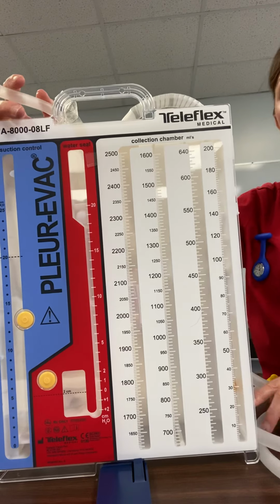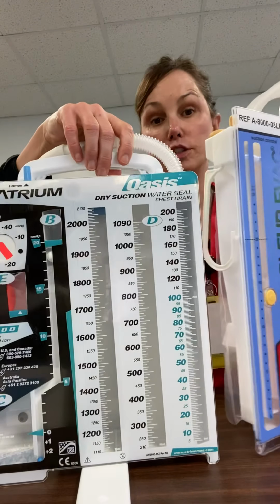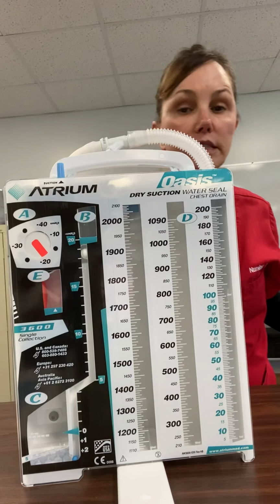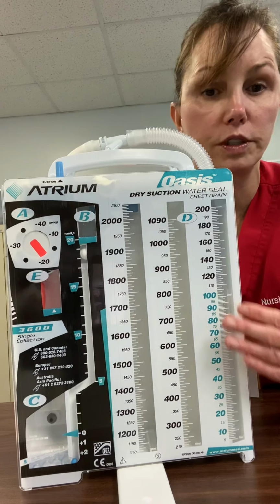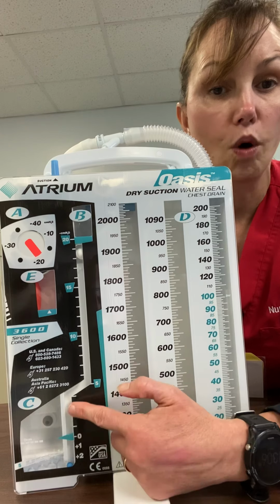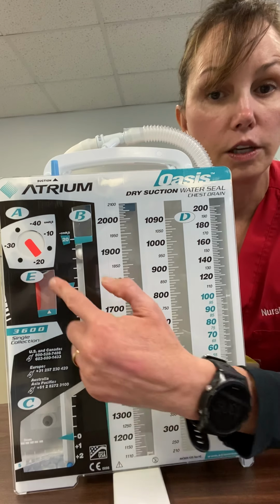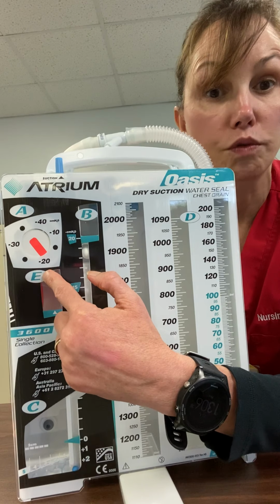Now, in contrast to that, I've got a dry system right here. The difference with this system is that there is no water in the suction control chamber. So it still has the same collection chamber. It still has the same water seal. The only thing is that the suction control is dry.